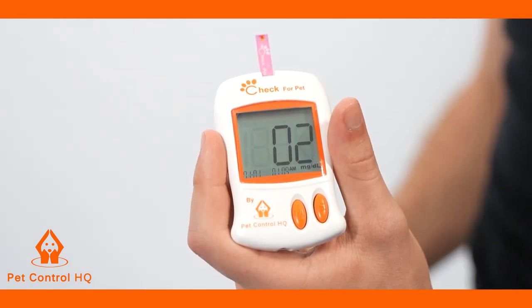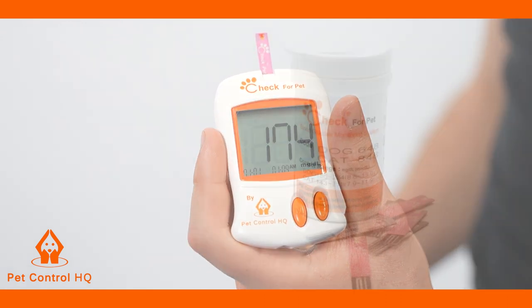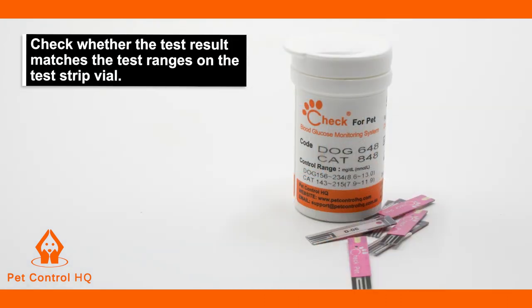After a seven-second countdown, the result will appear on the meter screen. Check whether the test result matches the test ranges on the test strip vial.